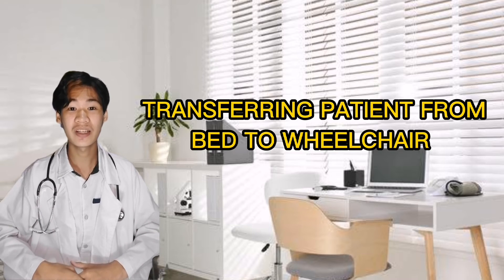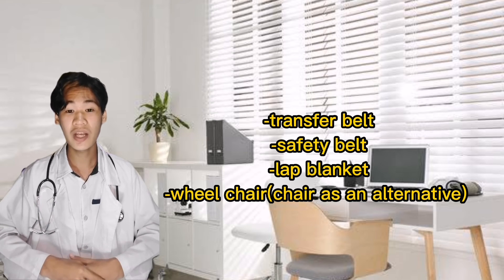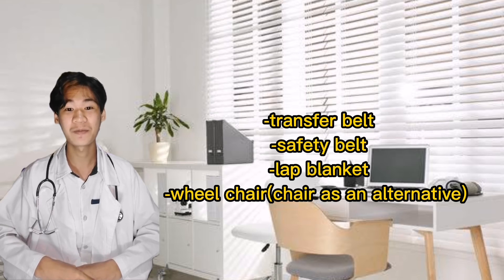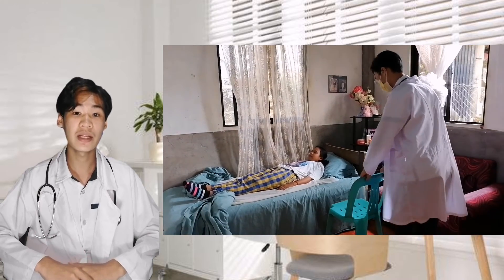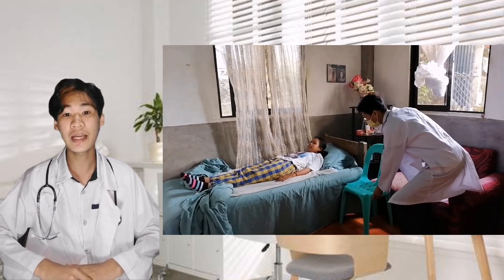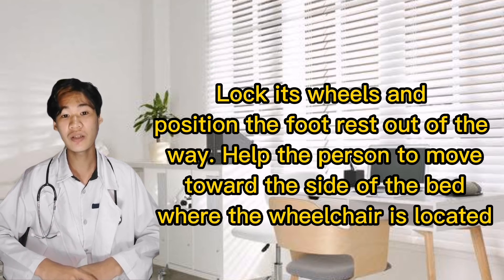To transfer a person from bed to a wheelchair by yourself using a transfer belt, begin by gathering your supplies: a transfer belt, safety belt, and lap blanket. Lower the bed to its lowest position and raise the head of the bed as tolerated. Make sure the bed's wheels are locked for safety. Fan-fold the top linens to the foot of the bed. Position the wheelchair next to the bed, facing the foot of the bed. If possible, brace the wheelchair against the wall or a solid piece of furniture to keep it in place. Lock its wheels and position the footrests out of the way.